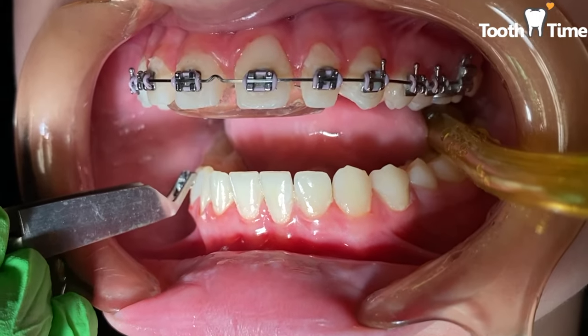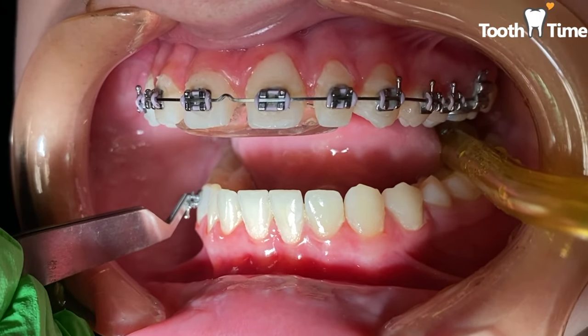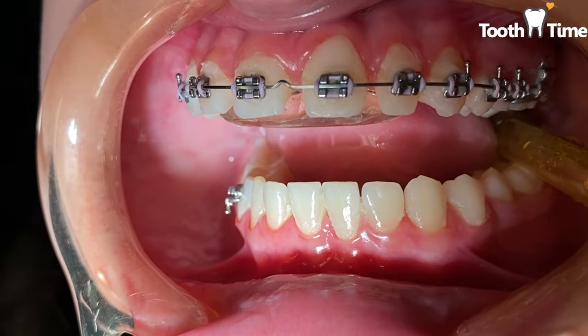As you can see, this appointment is pretty straightforward. The patient's been in the appliance for about 5 months, so now we're ready to go ahead and put the braces on the bottom.